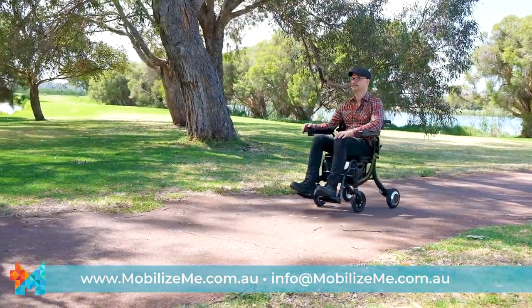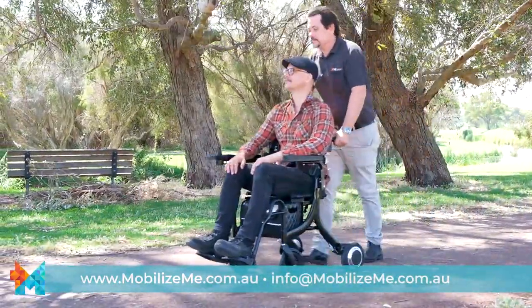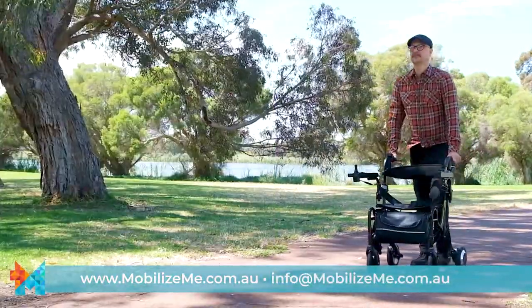Whether you use your eTraveler Evo as a lightweight electric wheelchair, a push-assist wheelchair, or as a rollator, we are sure you will be as impressed as we are.